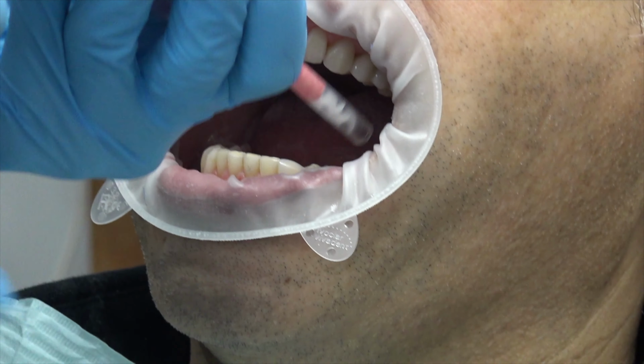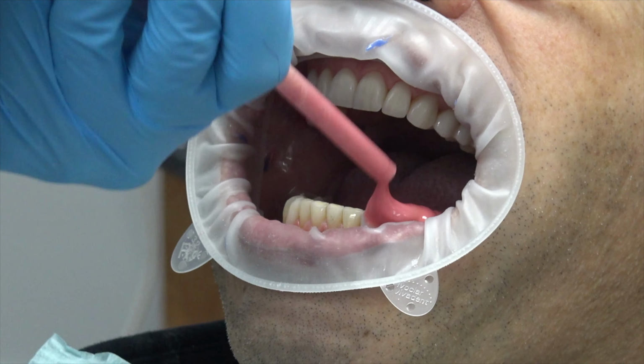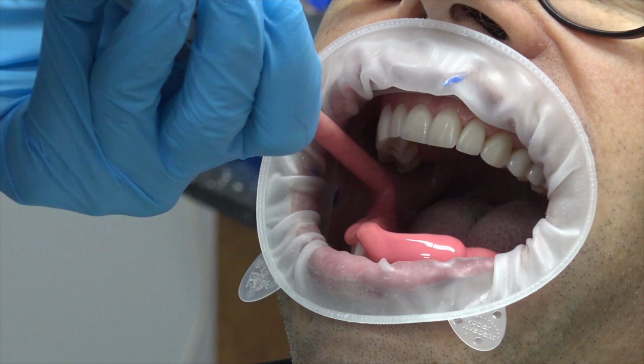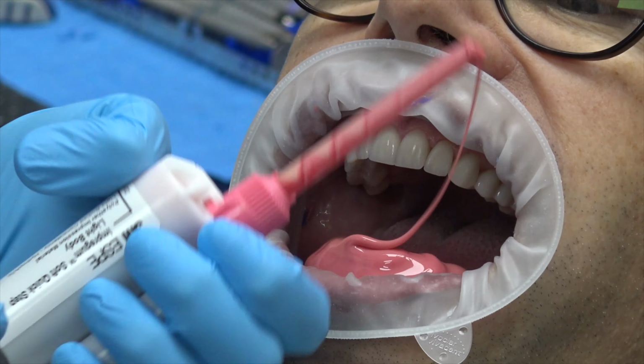To do that, we typically take provisional impressions using polyether impression material. Typically we use Impregum, one of the Impregum soft materials. Permadyne is what I use for final prep impressions, but it's too stiff for provisional impressions.